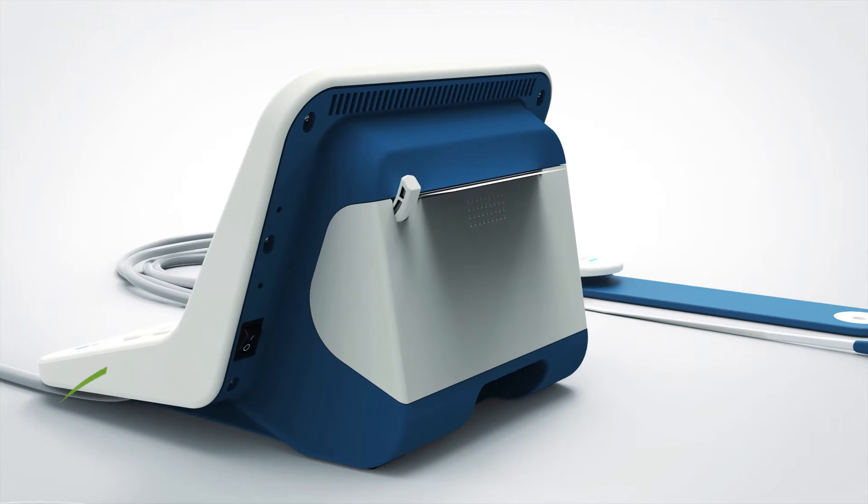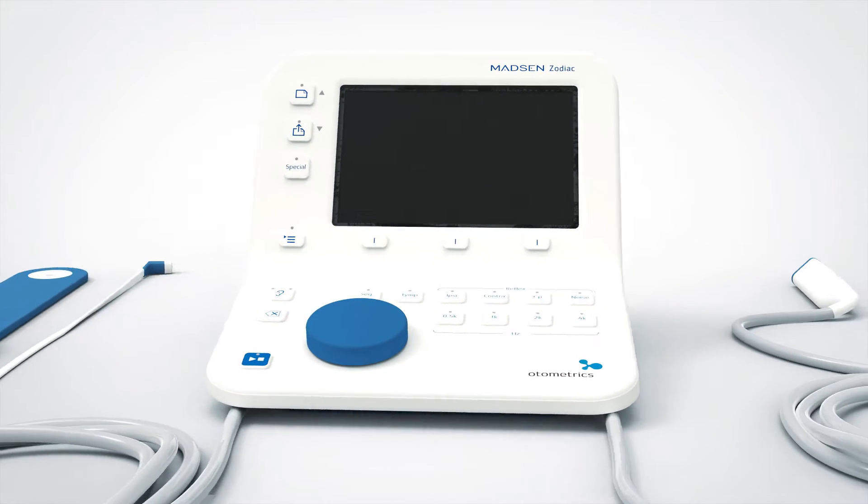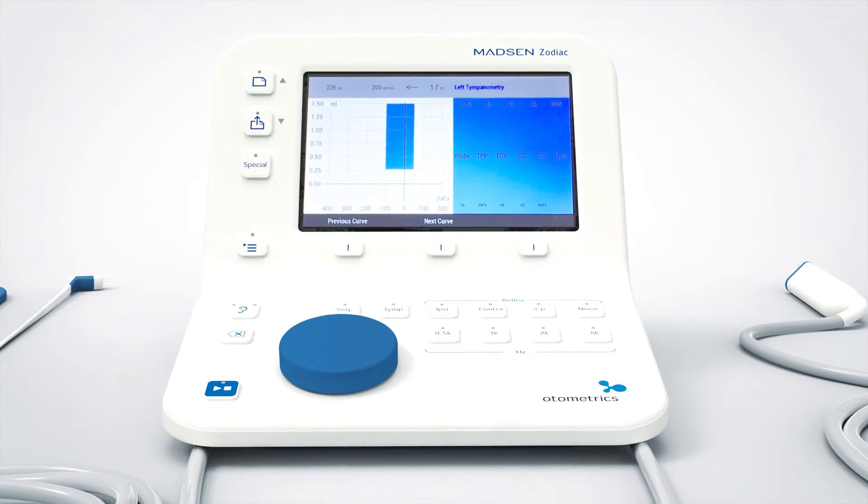After turning on the device by pressing the on-off button located behind the right-hand side of the screen, I reach the main page where I can access information about the tympanometry or the reflex screening.